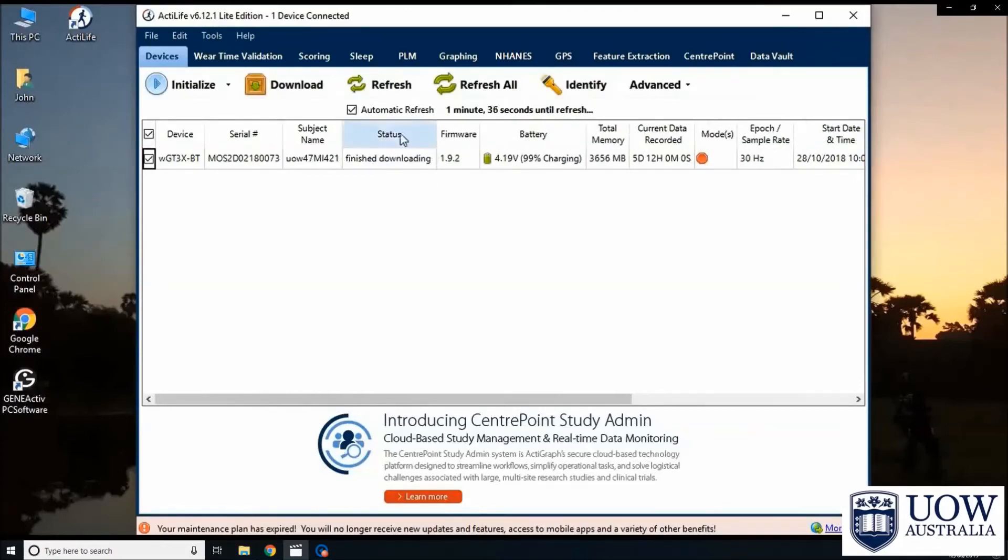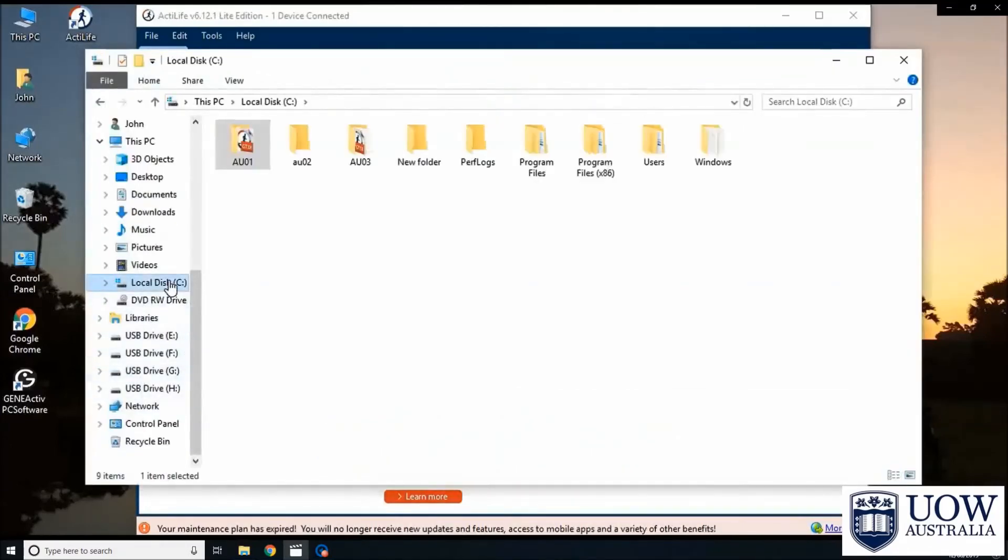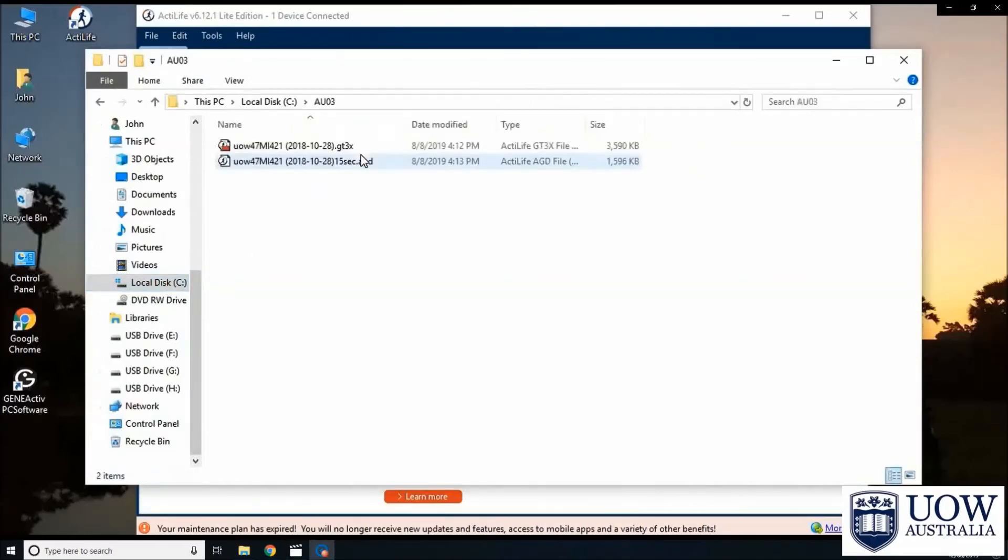Open the folder to make sure that the data have been downloaded successfully and to ensure that the file naming is correct. You will find two data files created for each participant.